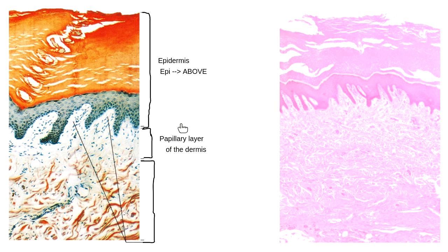The papillary layer of the dermis gets its name because it's got these up and down wavy patterns here. These up and down wavy patterns that you see are called the dermal papillae. So I'm going to add that word for you, dermal papillae. And I promise we'll talk more about this in lecture, lesson number 7 about the skin. But the dermal papillae, these little fingers, are regions where this part of the dermis reaches up and interacts with the epidermis.